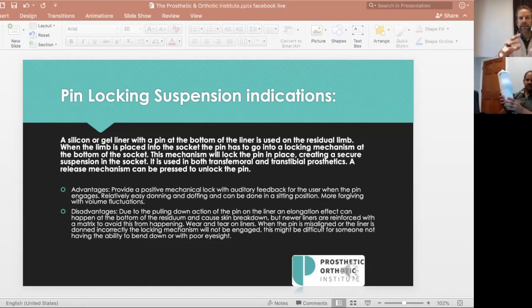So throughout the day, they're going to be putting them on, actually probably adding, correct? That's correct. So initially in the morning, what you're going to find, especially as a new amputee, is that your limb is full of fluid, more swollen, more edematous. You're going to find it's just really kind of firm, and that's very consistent, normal aspects. You put your prosthesis on, you may go to the kitchen, you may walk down the hallway, you may even go out and about to check the mail.